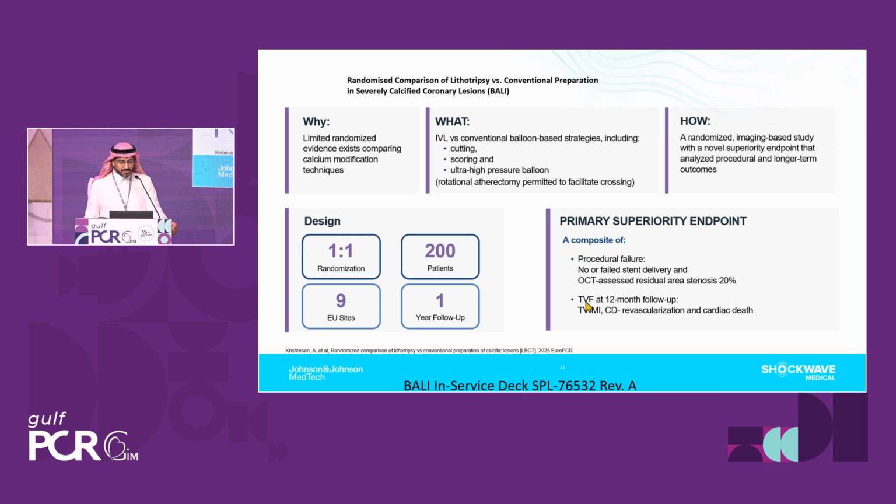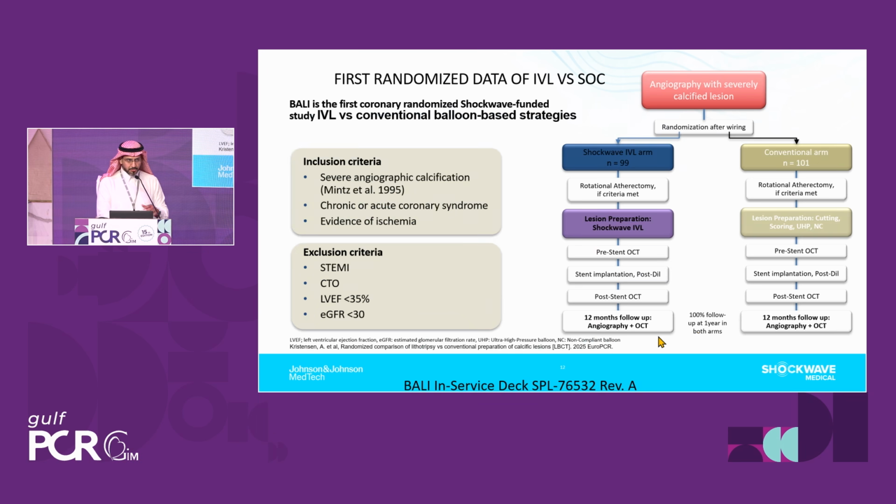Then target vessel failure at 12 months follow-up: MI, clinically driven revascularization, and cardiac death. So let's go through this carefully, because this is a very interesting trial.